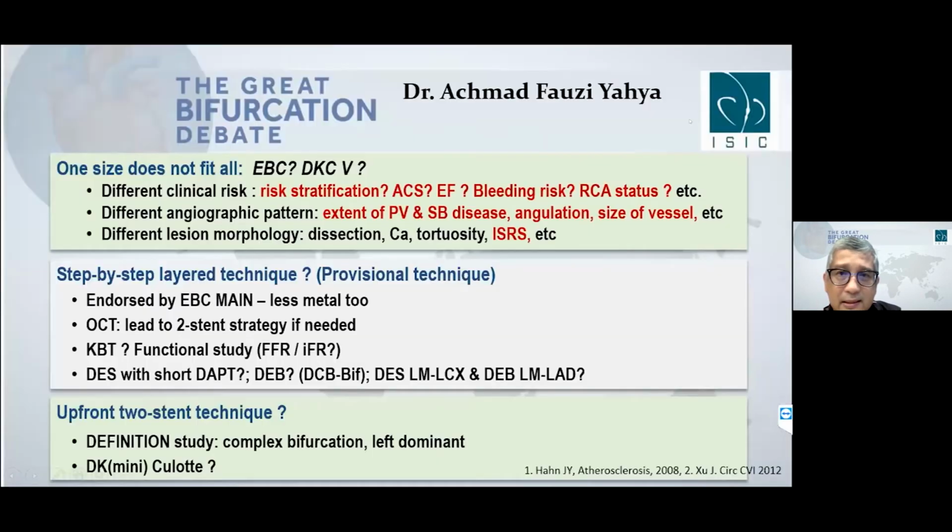But the other information that I need to know is the brand of the old stent, because definitely, if you look at the OCT, this is really underexpanded. 2.75 in the left main to LAD is really small, so there's no surprise in the OCT findings. This is an underexpanded stent. Whatever strategy you choose, you must be aggressive doing pre-dilatation.